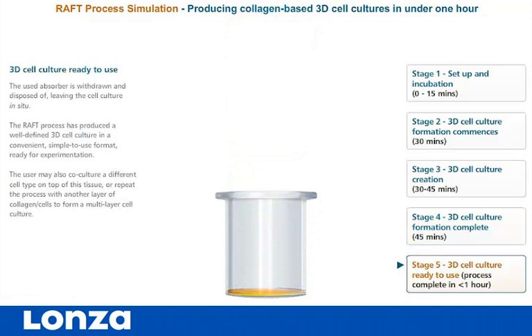The user may also co-culture a different cell type on top of this tissue, or repeat the process with another layer of collagen and/or cells to form a multi-layer cell culture.